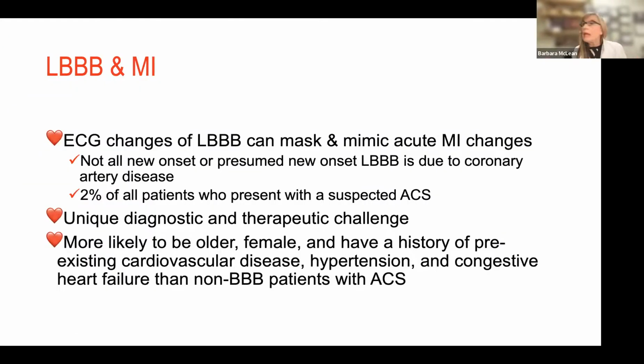Now, with LBBB and MI, what we can often see with these patients is that left bundle branch block mimics and masks acute MI.